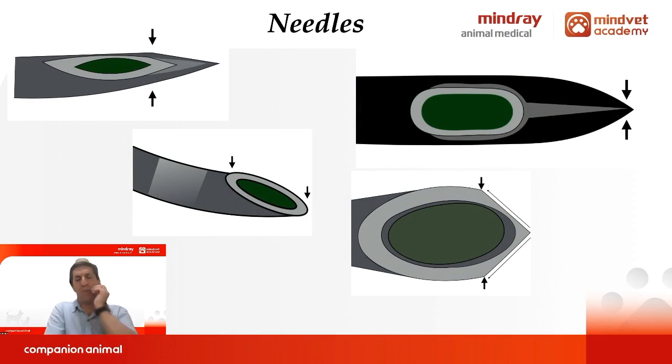Needles. This is perhaps a cornerstone discussion related to regional anesthesia.